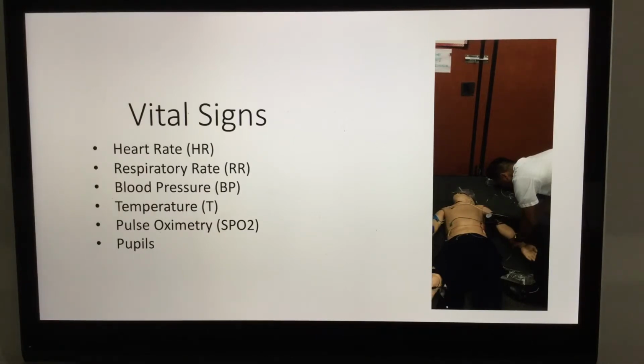So that's the width of the cuff. Then the length of the cuff. When we wrap the arm up, 2/3 should be underneath that. We shouldn't have half, or it shouldn't be just long enough for us to put the Velcro on. So we need to have the proper size blood pressure cuff. Place that on so that it's snug to the arm and won't slide off.